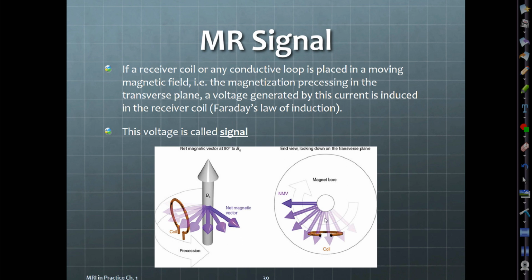This is a diagram if we looked at the top, right? Imagine we are looking right down at B sub 0, or the longitudinal axis is coming at us. So let's label that. That's our longitudinal axis coming right at us, M sub Z. And this right here is our transverse axis going around. So it just wants to show you how it rotates around it 360 degrees.